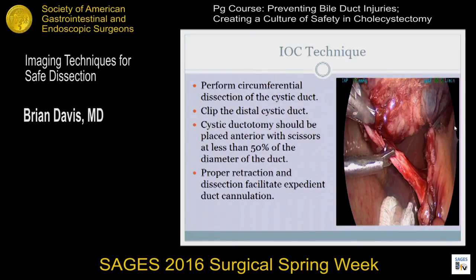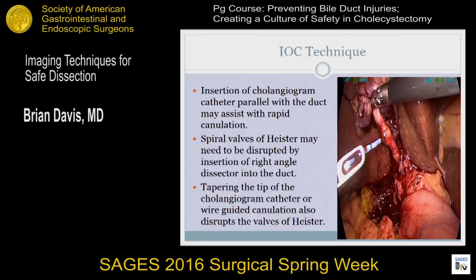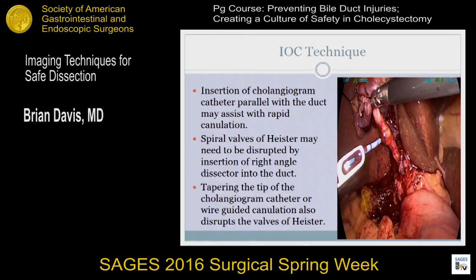Just a few notes on technique. These pictures from Dr. Bursi demonstrate the critical view of safety as well as operative technique for intraoperative cholangiogram, demonstrating circumferential dissection of the cystic duct with ductotomy less than 50% to prevent avulsion, and proper lateral and anterior retraction to move the cystic duct away from the common duct. I tell residents to approach the duct with the cannula in a parallel fashion to facilitate cannulation. The failure rate is often from valves of Heister, which may need to be ruptured with a right-angle clamp, scissors, or a larger ductotomy, or treated by tapering the cannulation catheter and using a wire-guided technique.